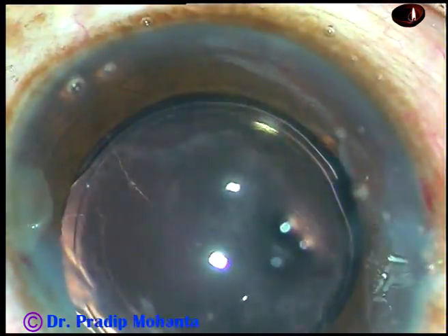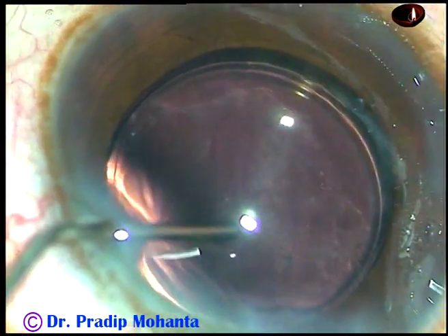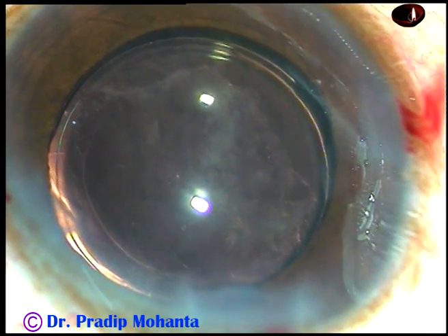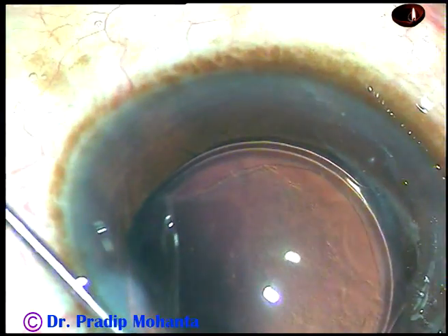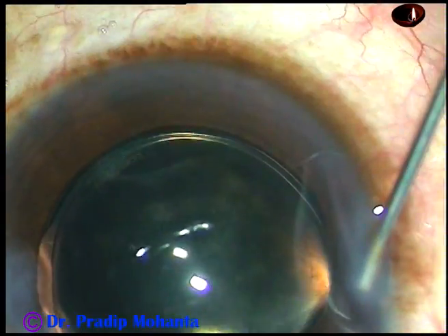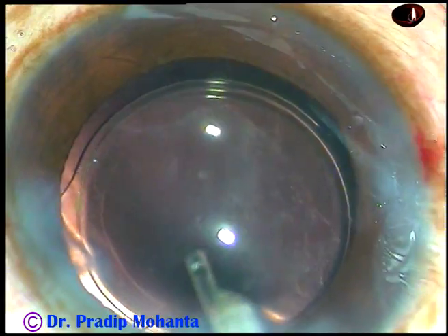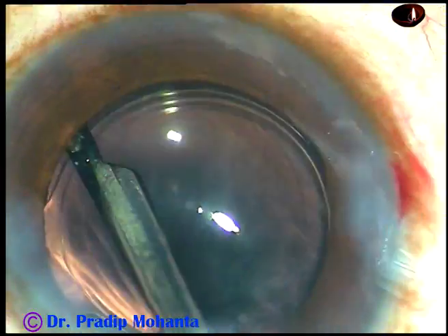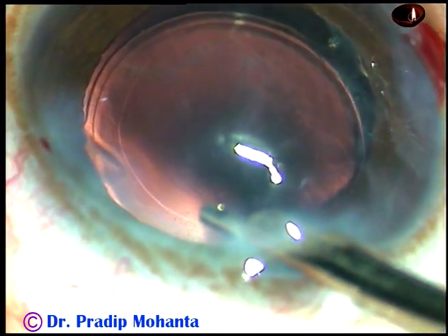And now a little bit of irrigation of the anterior chamber is being done to remove the viscoelastic that was in the lumen of the cartridge. This is a wash of moxifloxacin. Now I use BSS to hydrate the side ports — to hydrate the stroma on either side of these stab wounds — and the lips of these stab wounds are opposed by stromal hydration. And now this is the final lavage of the anterior chamber; the viscoelastic that sticks to the corneal endothelium comes out at this time. If there is any residual cortex, that is also removed, the anterior chamber is formed and the case is concluded.